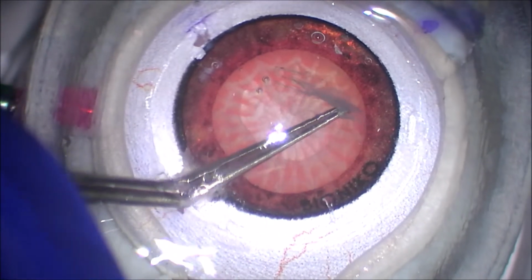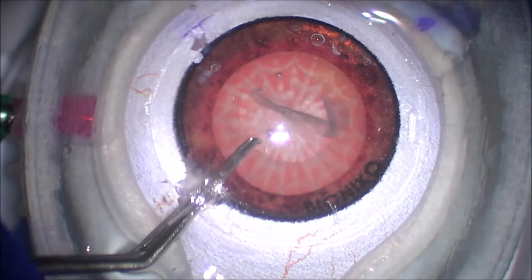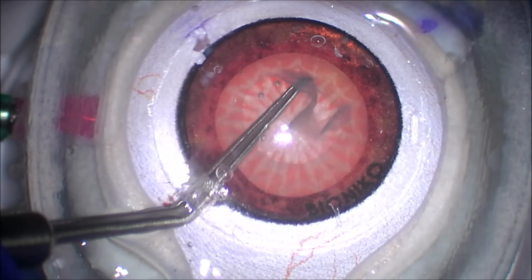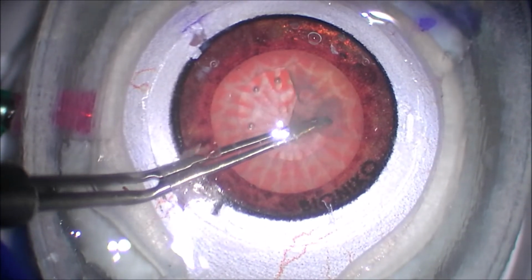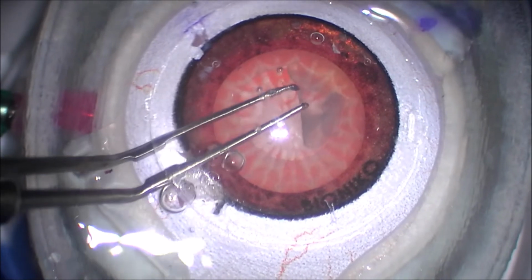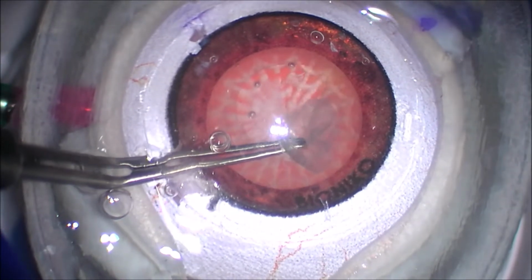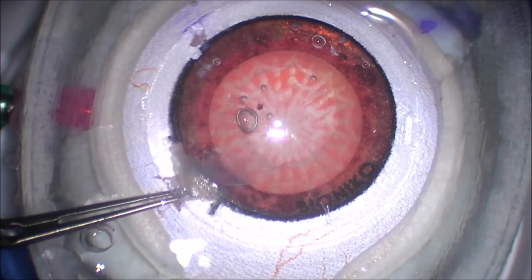Again, for the first time doing a capsulotomy, she was able to have a good understanding of the vector forces and creating that rexis. Again, I think that's the purpose of this simulation. Again, it's really a maneuver simulation and not a tissue simulation, again, stated by Bioniko. And so now you can see her, she finishes off the rexis. And that was very good.